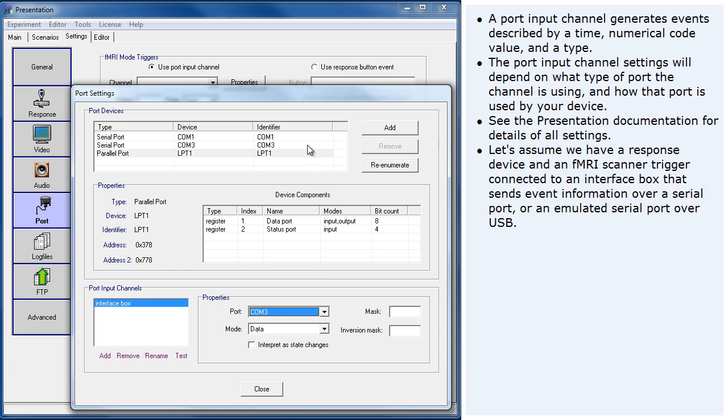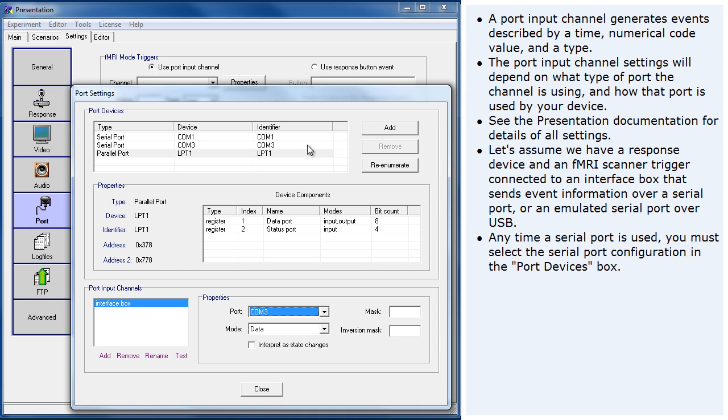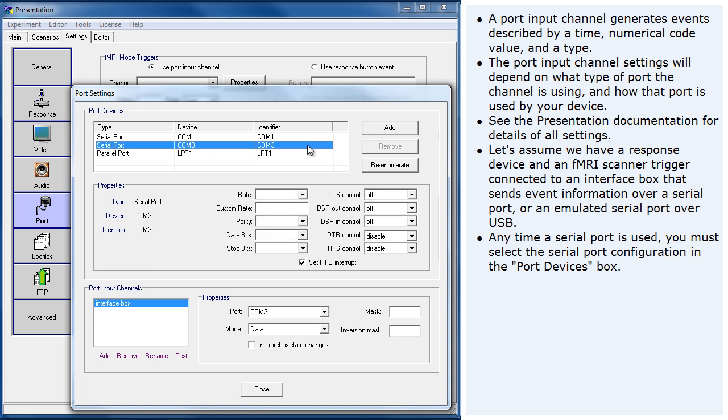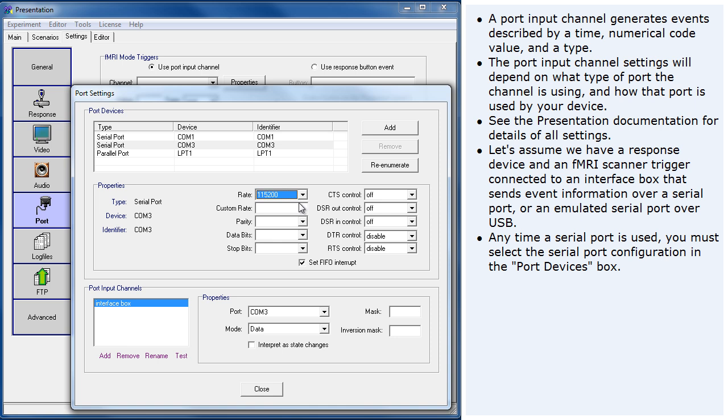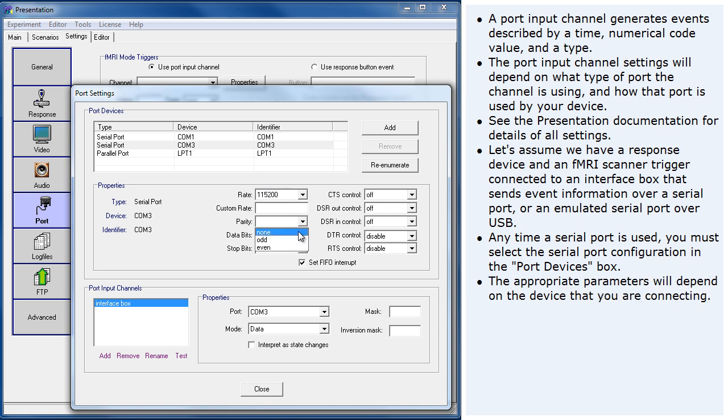Let's assume we have a response device and an fMRI scanner trigger connected to an interface box that sends event information over a serial port or an emulated serial port over USB. Any time a serial port is used, you must select the Serial Port Configuration in the Port Devices box. The appropriate parameters will depend on the device that you are connecting.